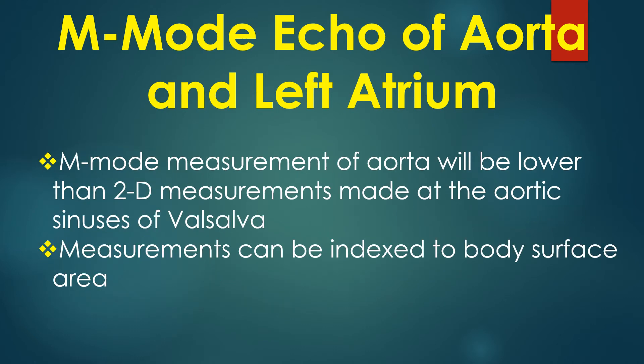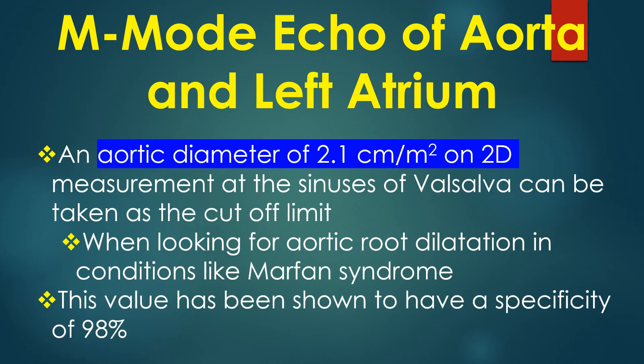M-mode measurement of the aorta will be lower than two-dimensional echocardiography measurements made at the aortic sinuses of Valsalva. The measurement can be indexed to body surface area. An aortic diameter of 2.1 cm per m² on 2D measurement at the sinuses of Valsalva can be taken as the cut-off limit when looking for aortic root dilatation in conditions like Marfan syndrome. This value has been shown to have a specificity of 98%.